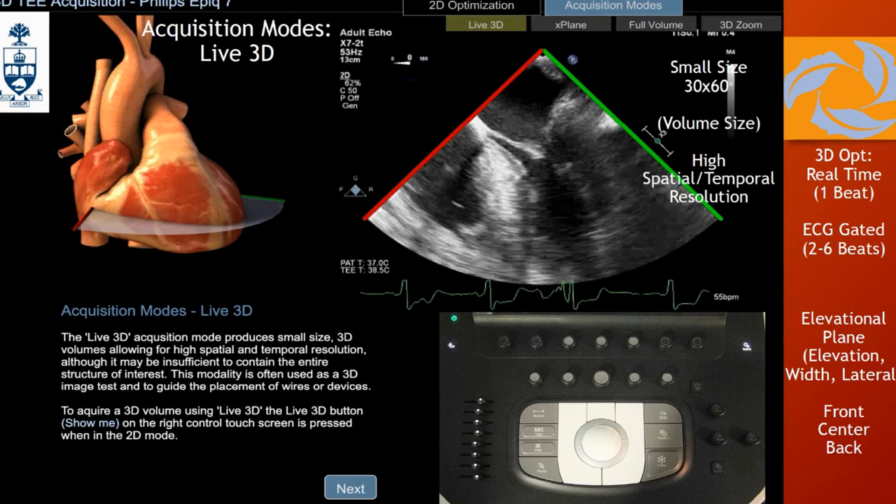But it's a good image for a short axis of the aortic valve — to get an impression of whether the valve is bicuspid or not. On the Philips, you have the elevation control so you can focus where you want: center, front, or back — and you can manipulate the position over the left ventricle. You can increase the elevational width to increase the sector, but you'll pay a price: whenever you increase your sector, your image quality decreases. This mode gives high temporal and spatial resolution, and is mostly reserved for procedural guidance, like catheter visualization.